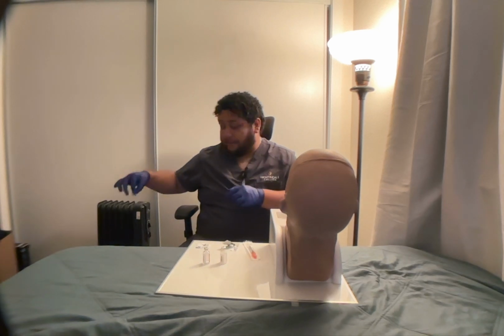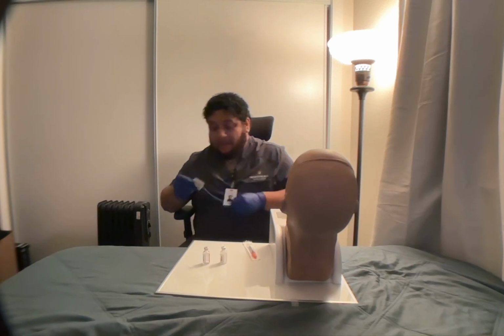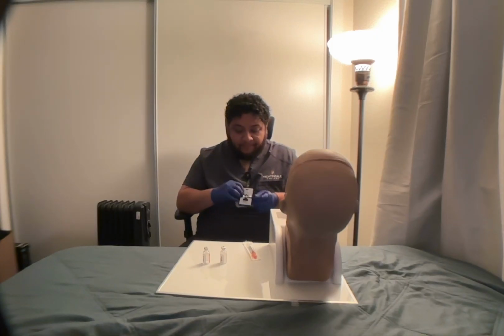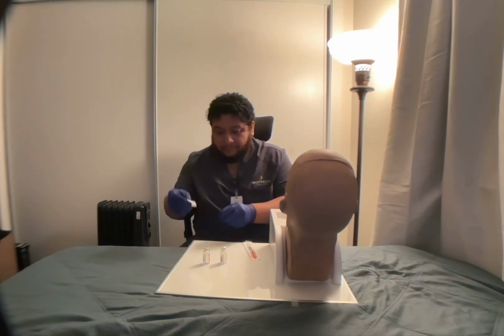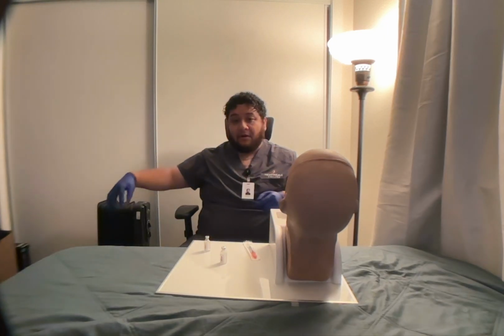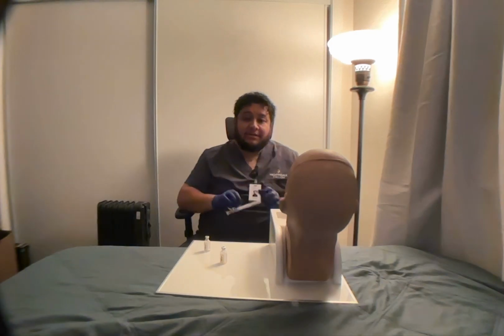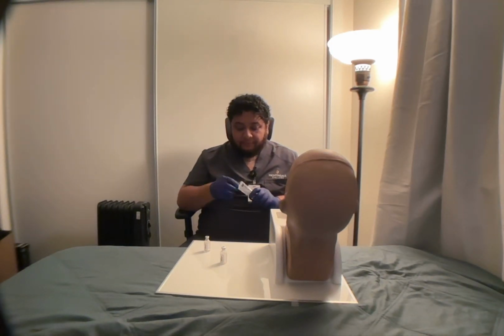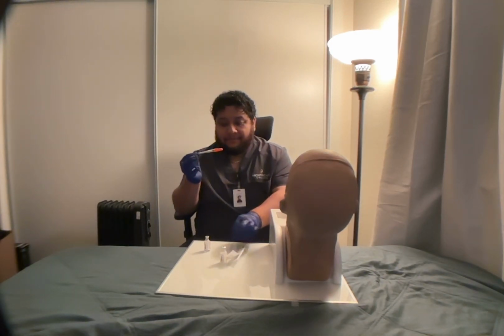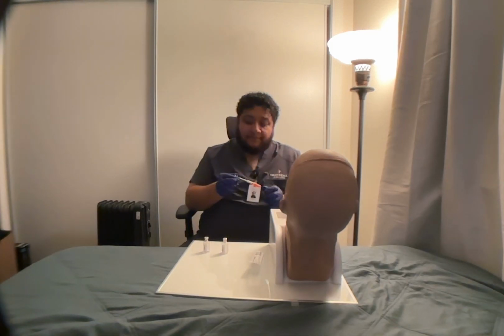My trash is here. I'm going to dispose of this. Another alcohol swab. Clean the top of the vial. Dispose of the alcohol swab once done. Now I'm going to retrieve my insulin syringe from the package. Put both vials next to each other.